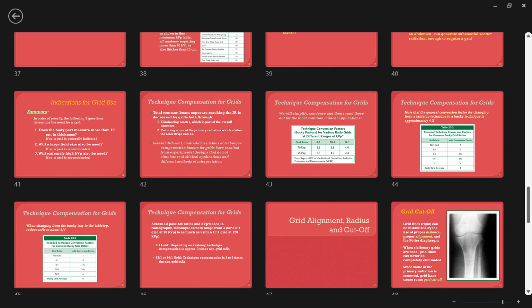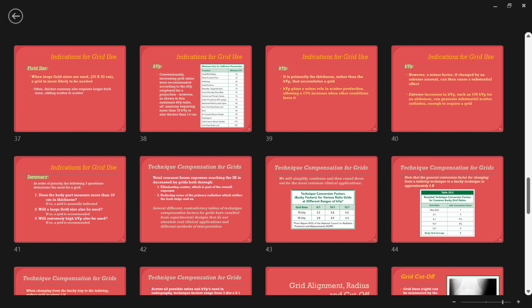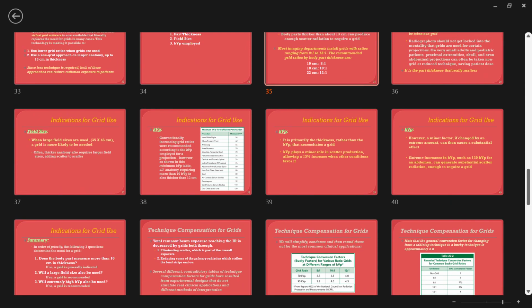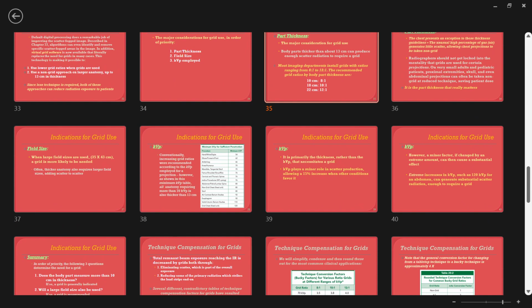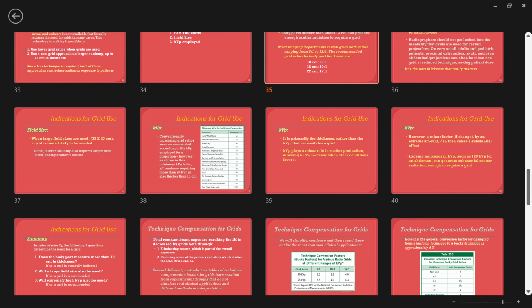Yeah, so you're going to adjust mAs typically. Okay. And you're right, your grids are fixed. You can't go and change out to a higher ratio grid when you've got a denser body part. I will say that in some cases, in larger facilities, they might have multiple grids to choose from, and that is the circumstance in which you would go ahead and use the thought process here and choose a different grid.